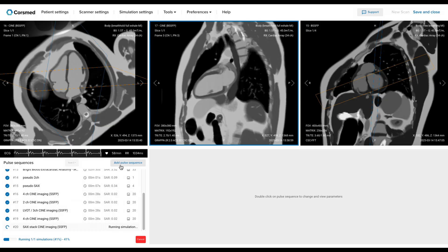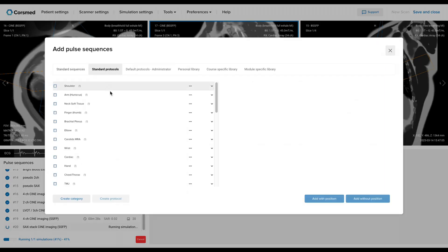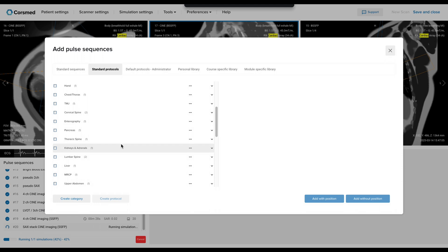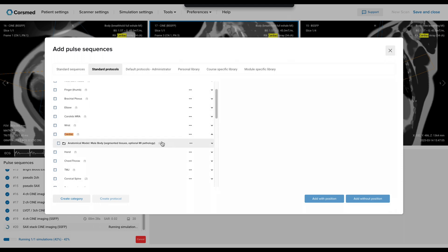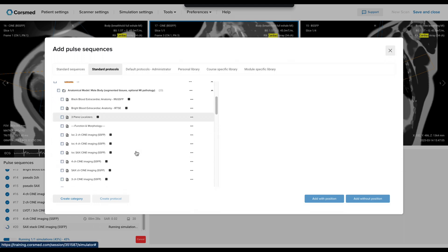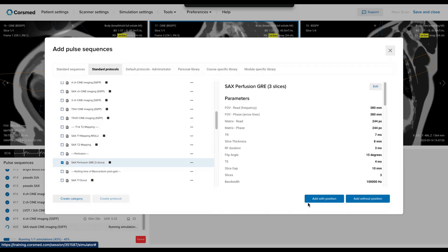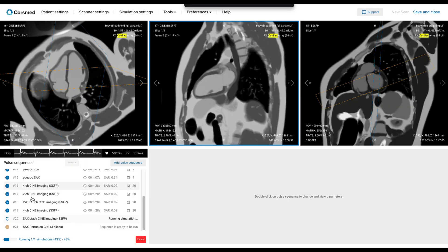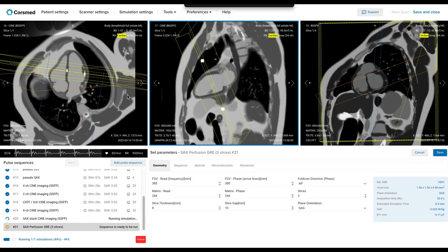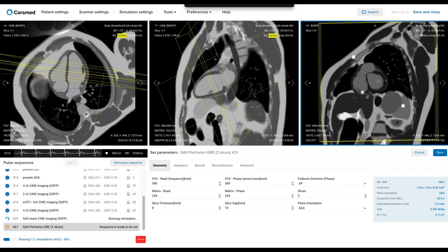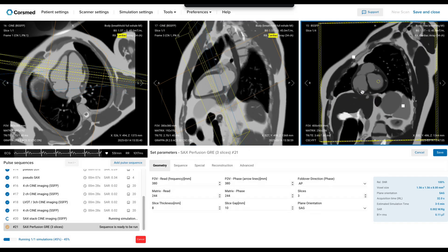Now let's start with perfusion imaging, the first of our three contrast techniques. The perfusion technique tracks the contrast as it flows through the heart. I'll find the sequence here and add it with position. This sequence will capture three short axis slices — basal, mid, and apical — to see the entire left ventricle from base to tip. For this viability study, we're only doing rest perfusion, no stress drugs like adenosine. We just want to see dead tissue, not test for blockages.